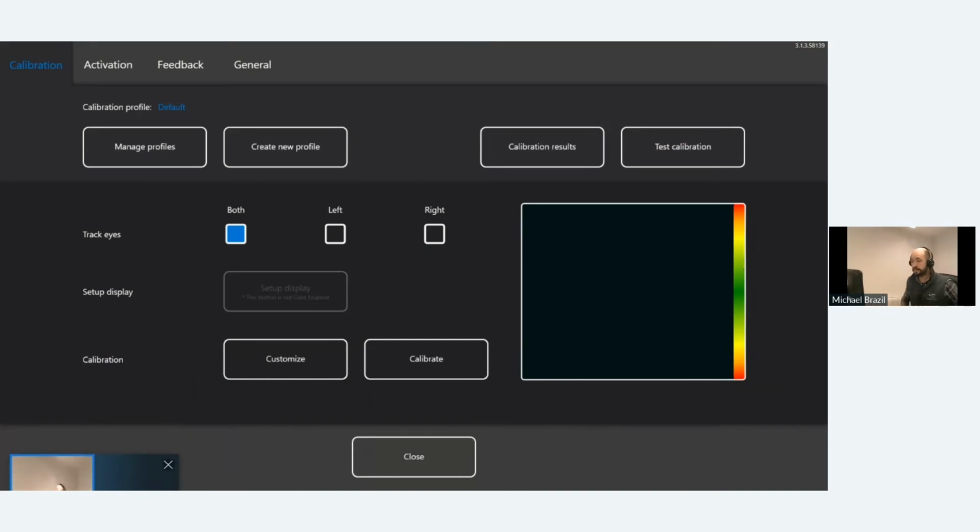So basically, you're seeing that track status box straight away, as I mentioned. You're seeing my eyes move around. I go left, and I go right, and my eyes are moving around. So I have a particular area where I have flexibility to move around. No matter where I am in that box, it will still track my eyes. So you can see me moving around. That's basically your scope to move around when you're using eye tracking.